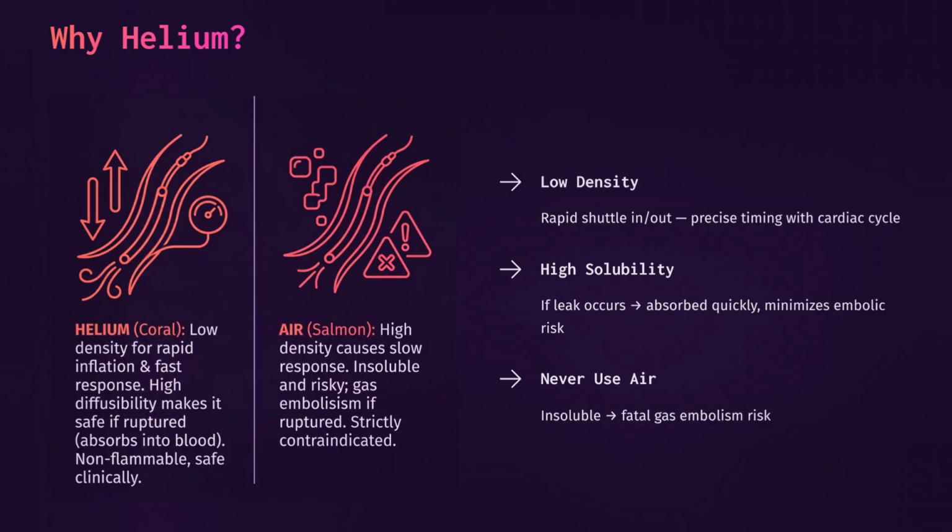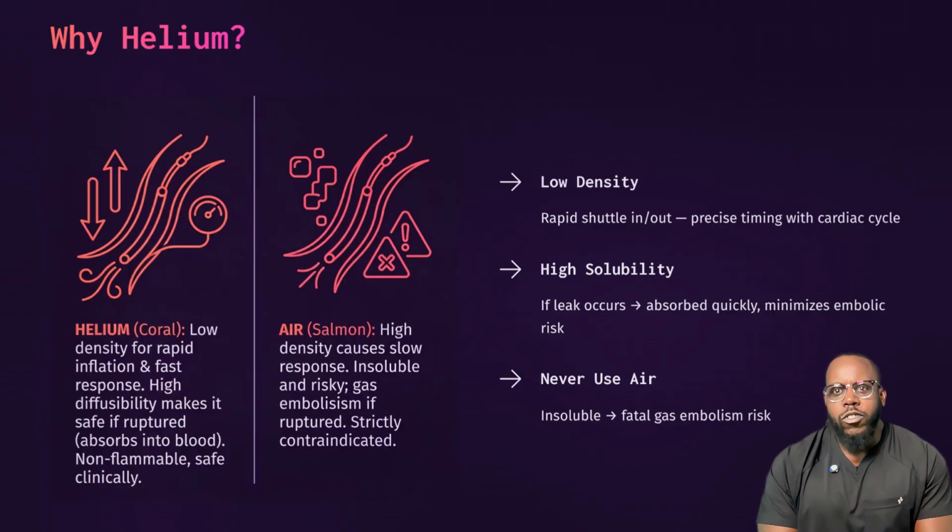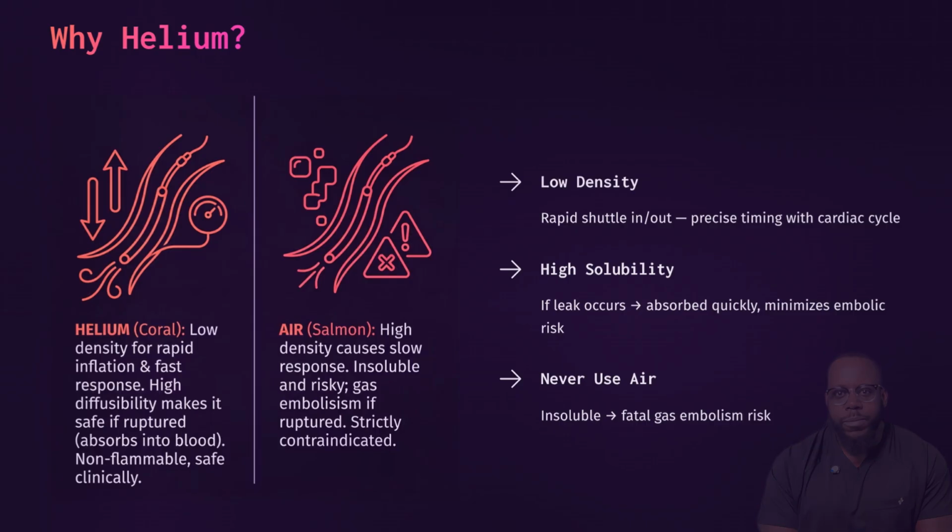Your clinical tip here: look at your gas lines. If you ever see flecks of dry brown blood or bright red blood in the translucent gas tubing coming from the patient, the balloon is ruptured. Stop pumping immediately. If you don't, you'll pump helium straight into their bloodstream and drag blood right back into your expensive console. So, why are we putting a balloon in the aorta anyway?